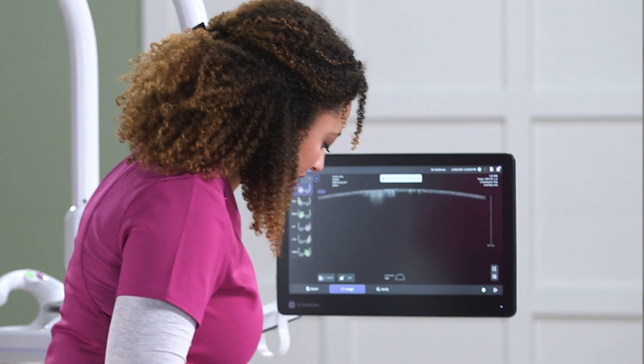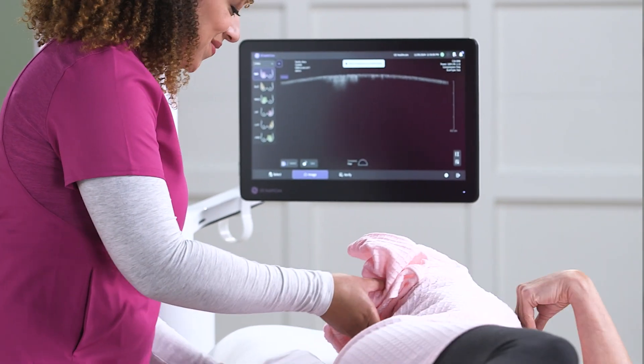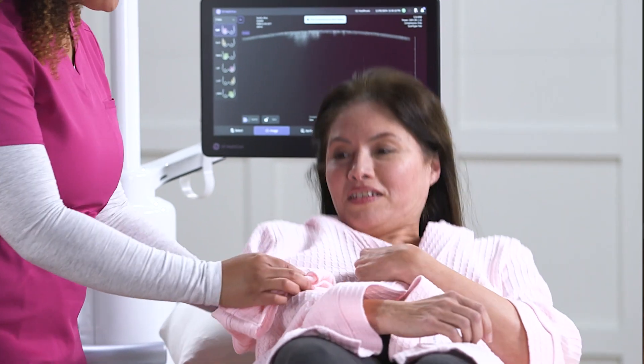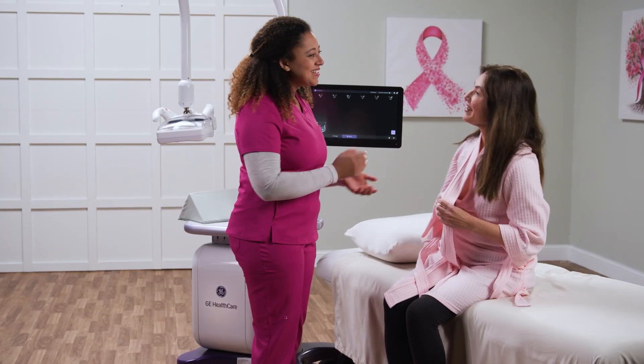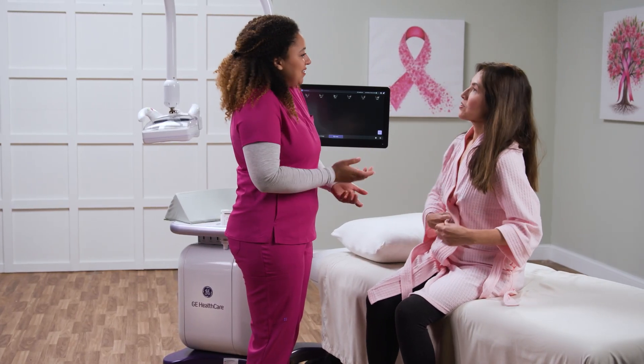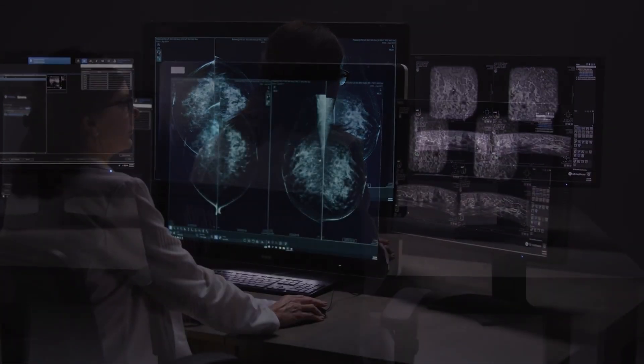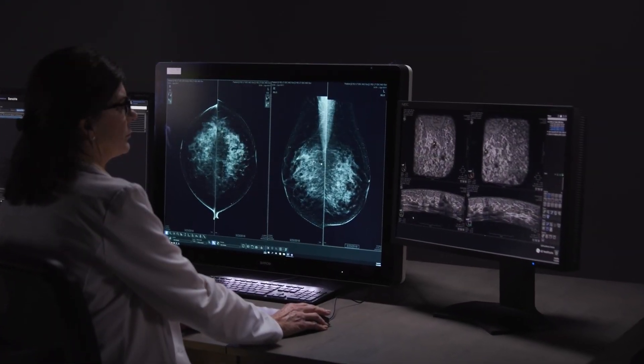The entire non-invasive and patient-friendly exam is typically around 15 to 20 minutes, which includes patient preparation and image acquisition. 3D volumes are sent to the Invenia Abus viewer at the end of the study to allow reading from anywhere.